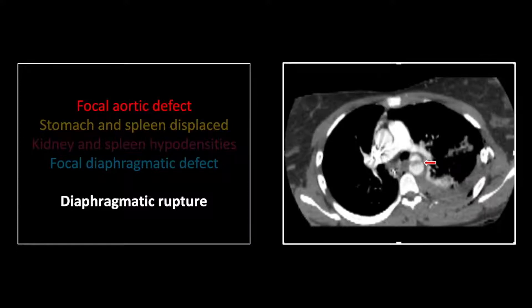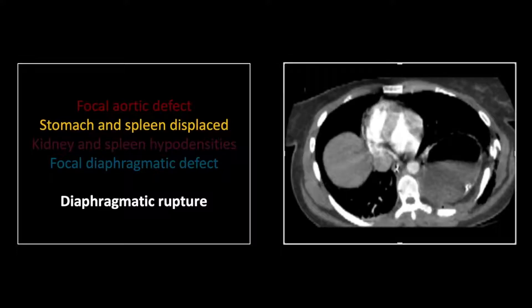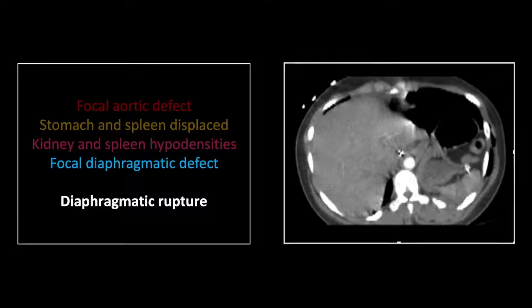You can see the contour abnormality of the aorta just past the isthmus in a fairly typical location. The stomach is elevated and occupies the inferior portion of the left hemithorax. On a lower cut, the spleen is also elevated with a peripheral wedge-shaped hypodensity suggestive of a thromboembolic infarct, most likely related to the upstream aortic injury.